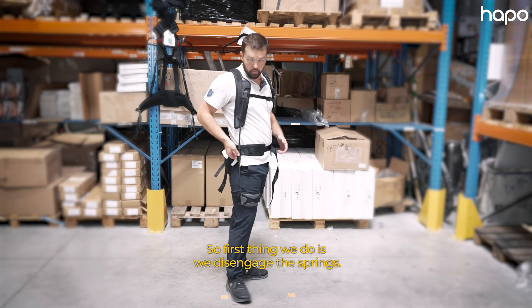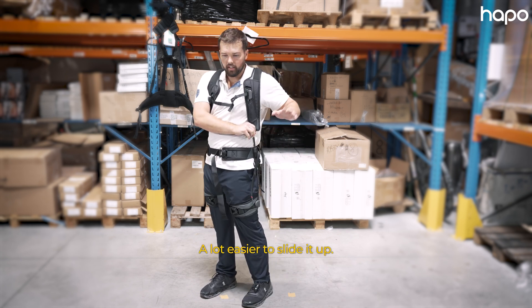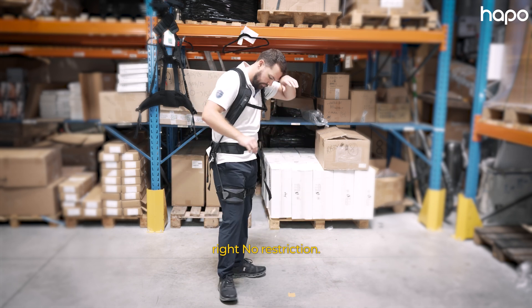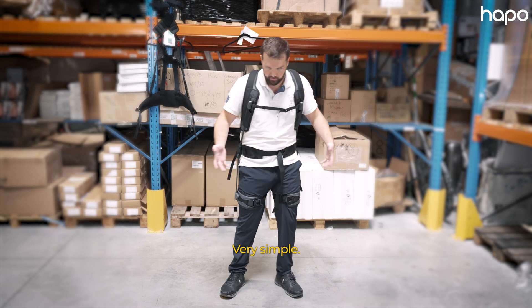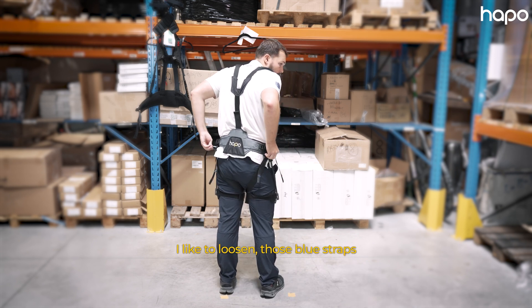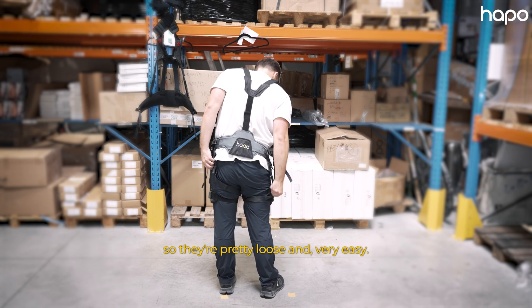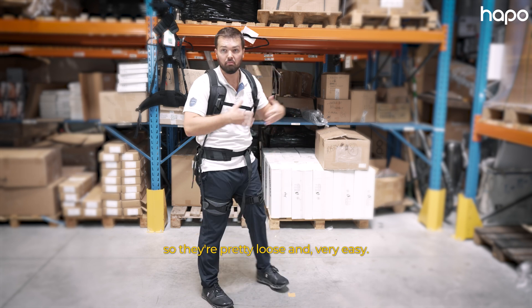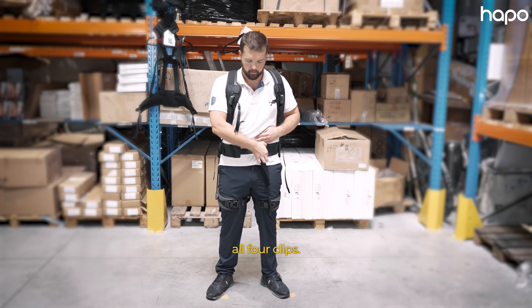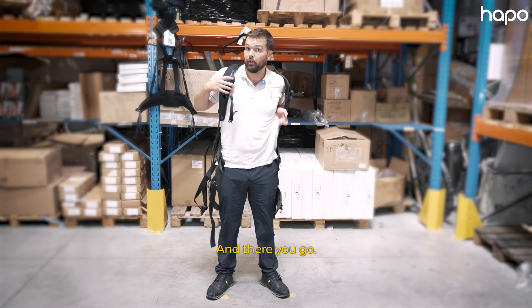First thing we do is disengage the springs — just slide it up. Now I can bend right, no restriction. I like to loosen those blue straps just to make it easier for next time. They're pretty loose and very easy. We're just going to go ahead and unclip all four clips — that's the waist, chest, and both thighs — and there you go.